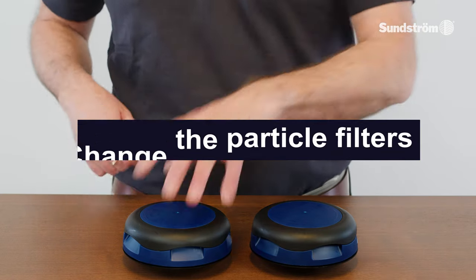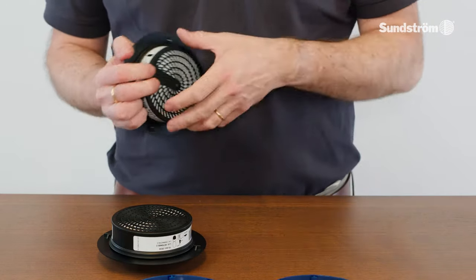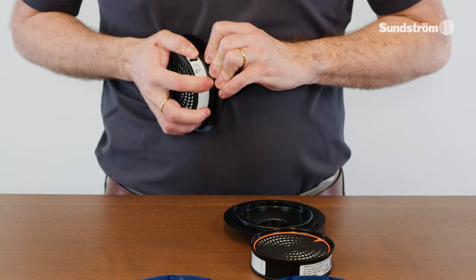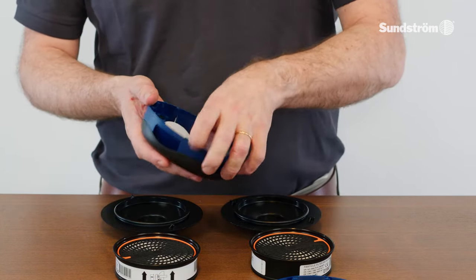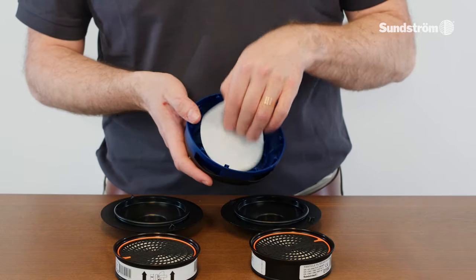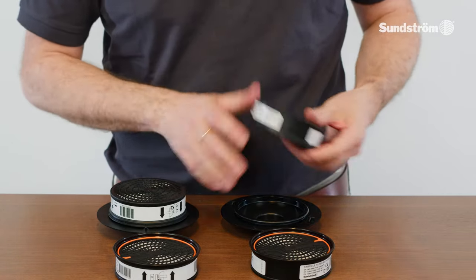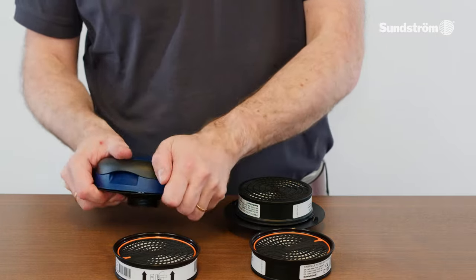Changing the particle filters. Both filters must be changed at the same time. Bend the pre-filter holder from the filter adapter. Place the thumb on the underside of the adapter and prise out the filter. Change the pre-filter by pressing in the middle and then remove it. Mount the new filters on the adapters and fit them in the fan unit. Fit the pre-filter holders back on the particle filters.